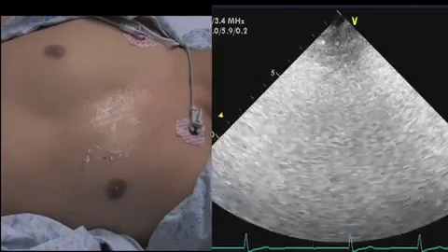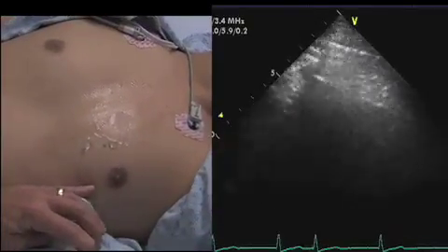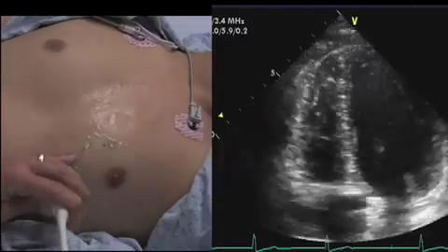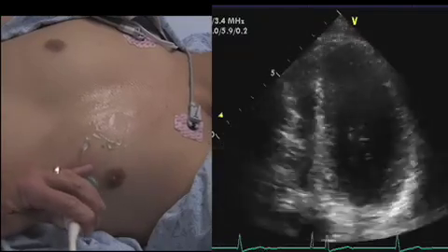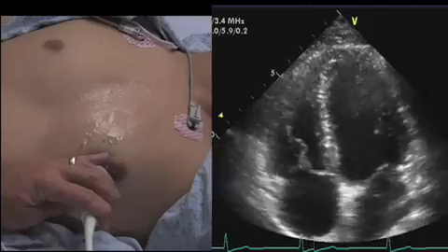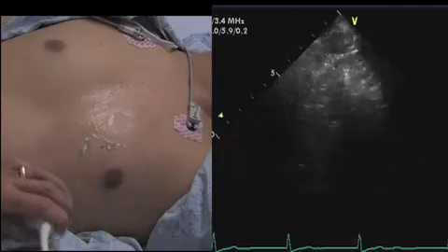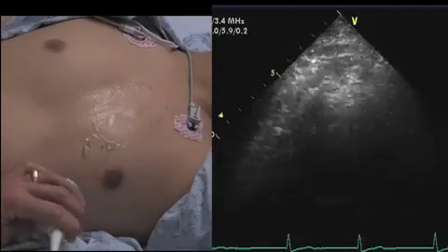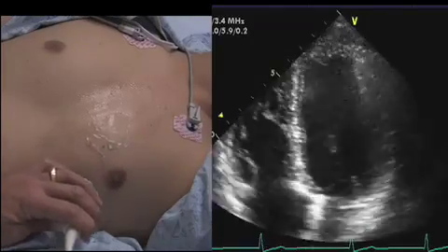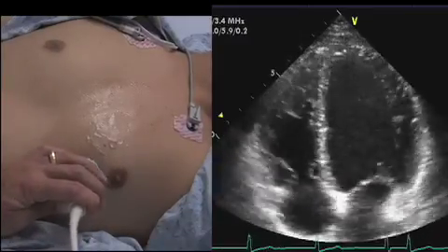I'll do the same for the apical view. First I'm going to start circling around — okay, you can see we're getting close. I'm going to make the circle smaller in the area where I'm closing in on it, and if I pass I can just back up on the circle and fall back into my view. See how big the movements are — very gross with my hand — and you can see what's changing on the screen as well. Just back up a little after I've passed something that's bright, then go into the nicer view.